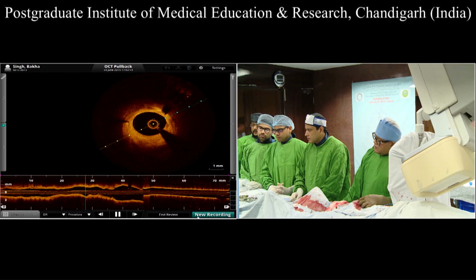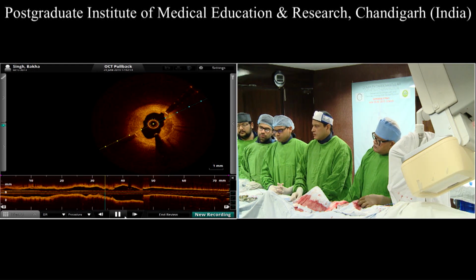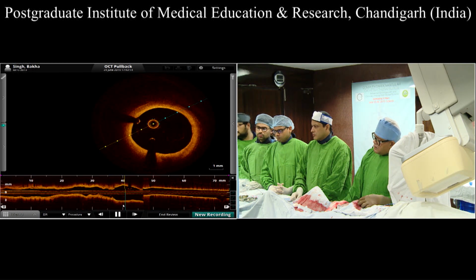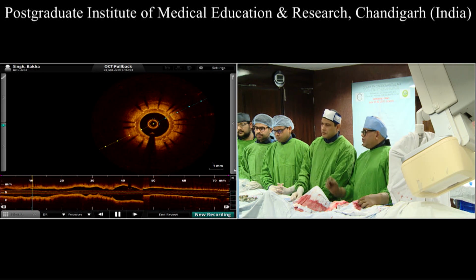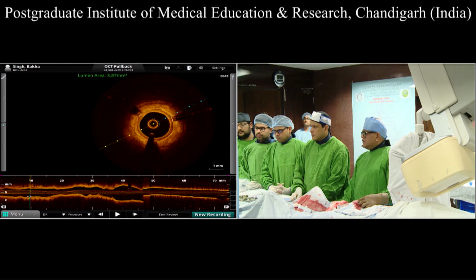Because if you have an underexpanded stent with calcium on the outside, you really face difficulties in expanding the old stent, and you need to do a very, very thorough job before you implant the next stent. So the actionable questions are: do we have underexpansion, and do we have calcium either inside or outside that stent? And that needs to be determined before you implant. Can you see the size of the vessel distally? Expansion of the old stent before you do that.